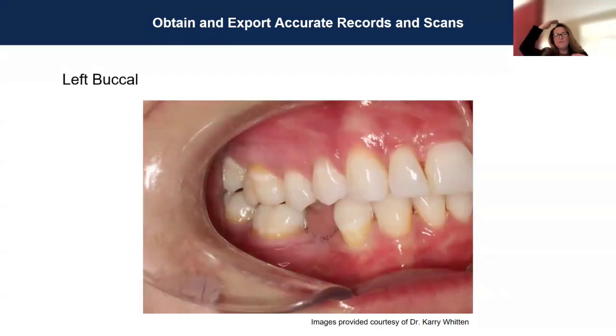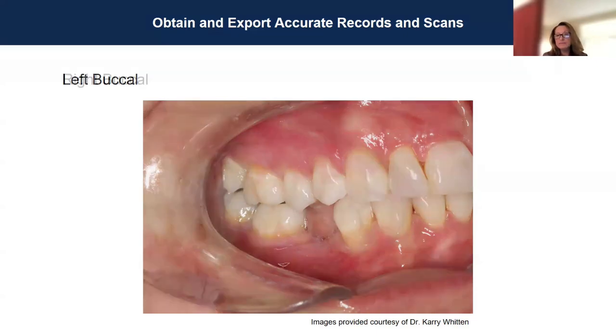And then when you are doing the face shot, you get it to their shoulders and their head. You don't need any other part of their body or have it way out in the air or the ceiling of the operatory. And then here is where I turned it to the Y-shaped side and have the patient bring it back, almost like a bow. And you can see that molar relationship for the malocclusion.